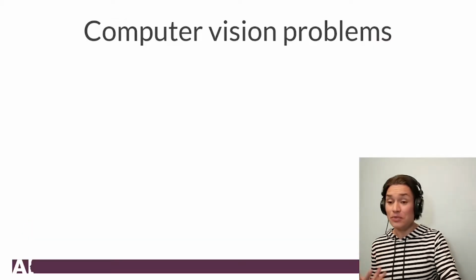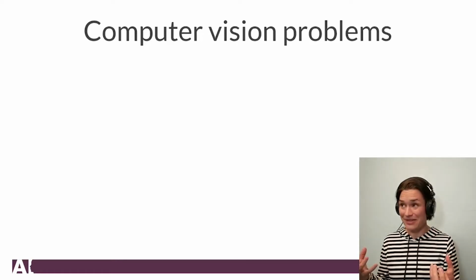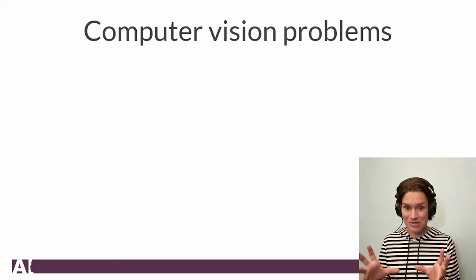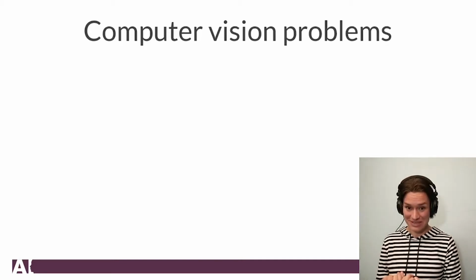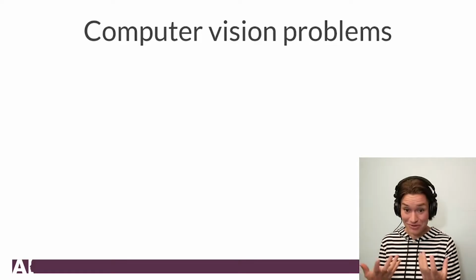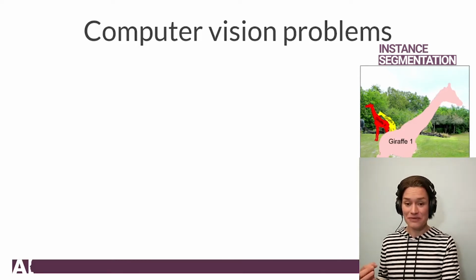So in computer vision, when we see everything, we don't have to think about, okay, do we only classify it, or maybe we should segment it, or maybe we should segment all the objects together. Computer vision is the part of computer science that tries to mimic human vision. So one of the challenges is, how do you split the task of human vision? Because we just see. And let's start with something that resembles human vision the most.